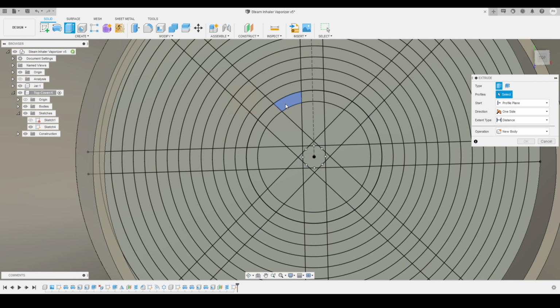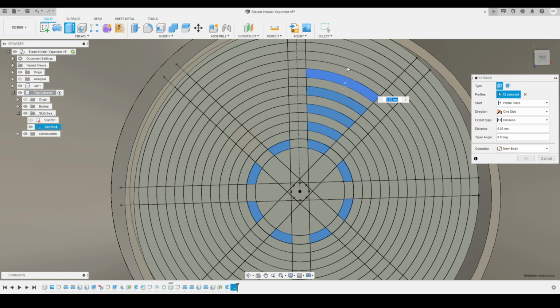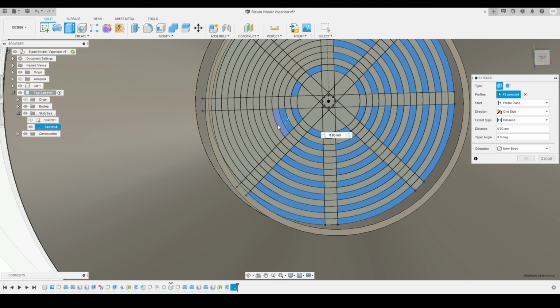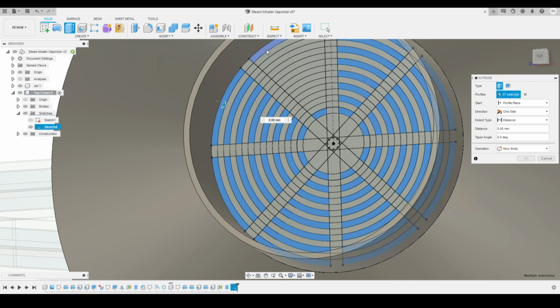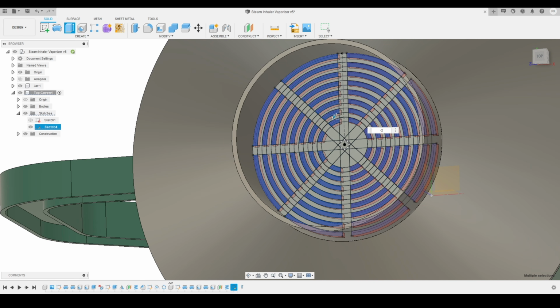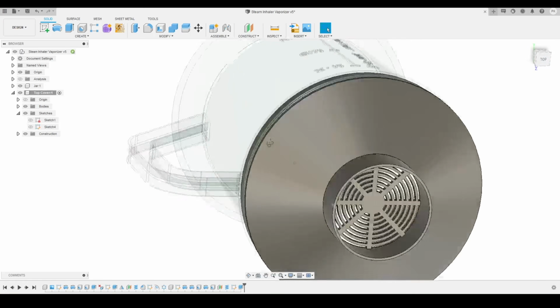I will activate the extrude tool and select all these alternate profiles. Here you can see these are all small profiles. I have to make sure that I'm not missing anything, so I have to select every profile very carefully. So here you can see I have selected all the profiles, then I provided the extrude distance and made an extrude cut like this. So this is the result we got.